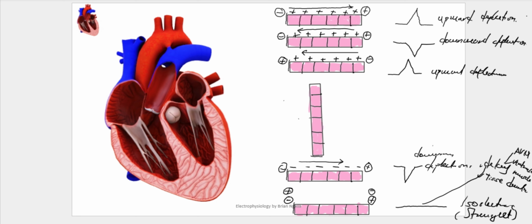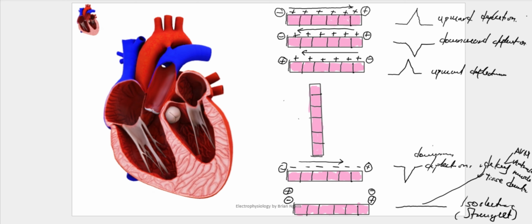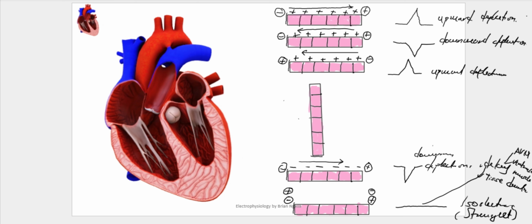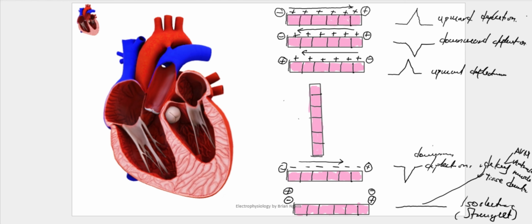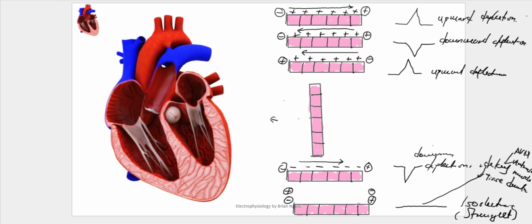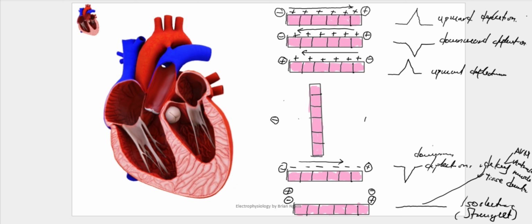This is to suggest that when they contract, their contraction is a little bit sustained, in that they tend to hold these positive charges a little bit before the wave of repolarization kicks in, and that might give us some of the straight lines that we'll be able to see. So still with this piece of muscle with cells, you can decide to place your electrode in a perpendicular manner. Let's assume that maybe you've placed your negative electrode on this side and your positive electrode on this side.